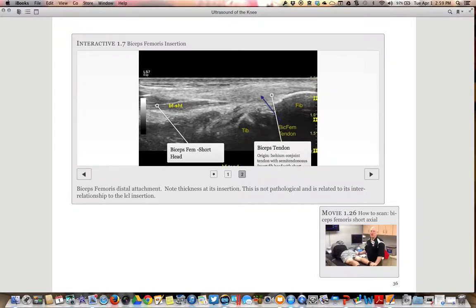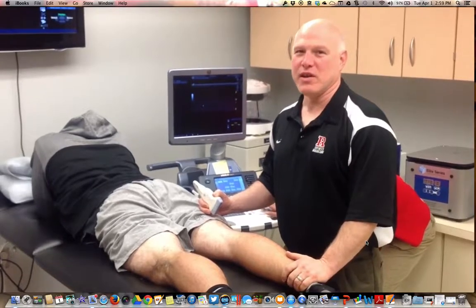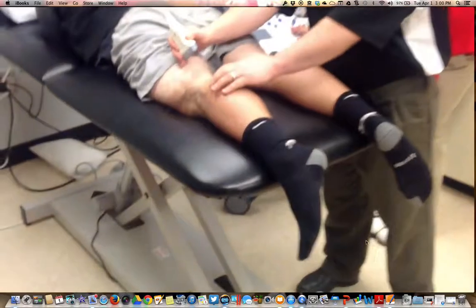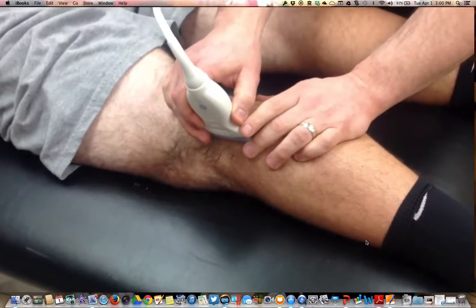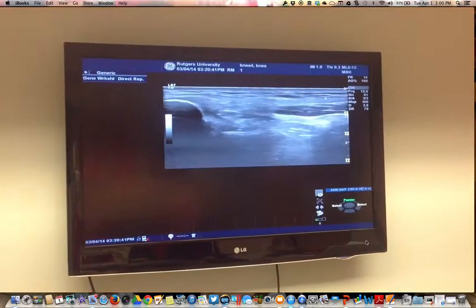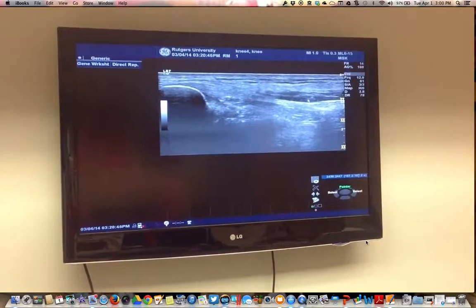It's also important to look at that in a short axis plane as we get very good details of the bicep short axis. Biceps femoris tendon in a short axis approach. This is very valuable when looking for hamstring tears. What we're going to do is find it again longitudinally by again palpating the fibula, placing the probe down over the fibula, going towards the ischium, where we will see the fibula and the bicep tendon in this location. As we follow up longitudinally, we will see the short head of the bicep muscle just below it here.